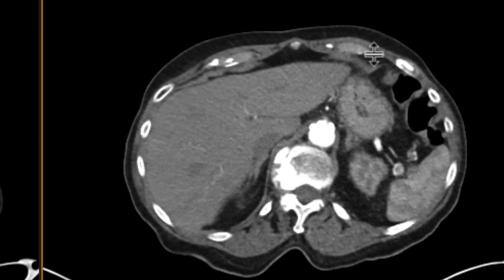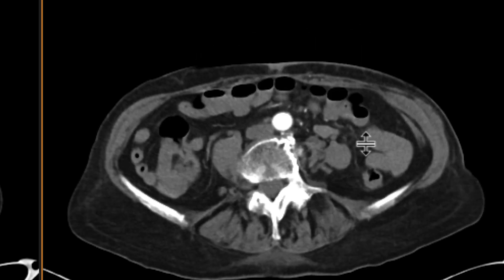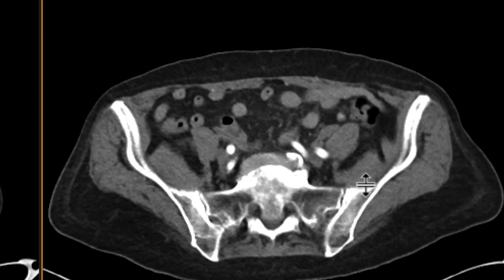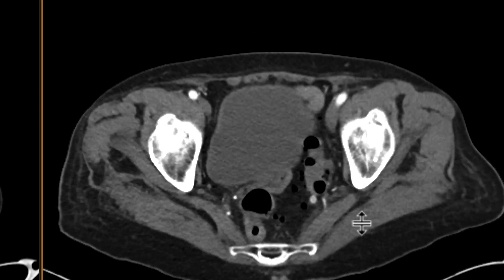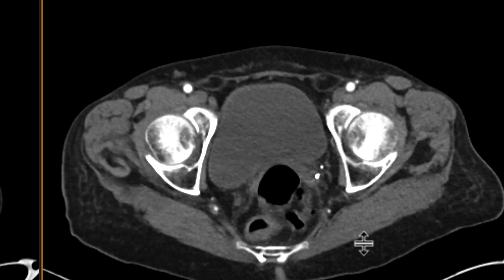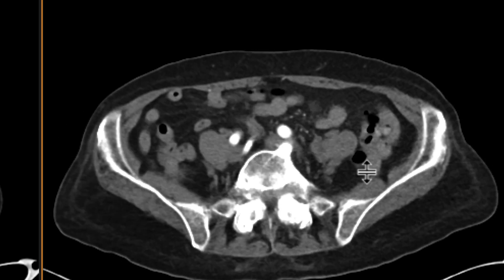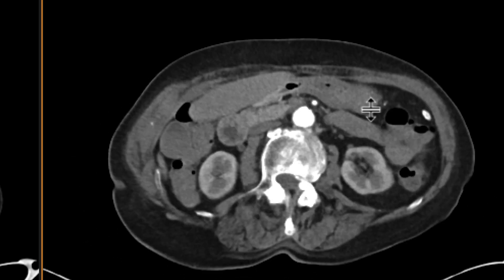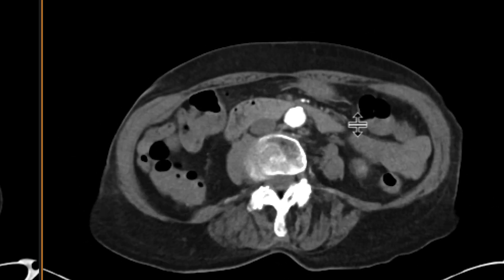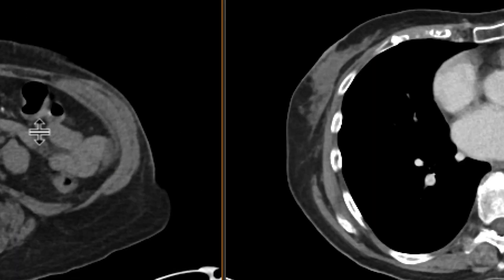As we go to our arterial phase, on first glance scrolling through all of this, it looks pretty okay. I don't see any areas of active extravasation. And I'll focus again back on the ileocecal valve.